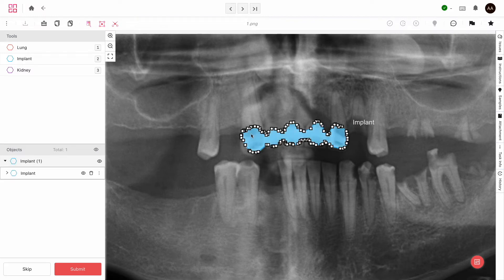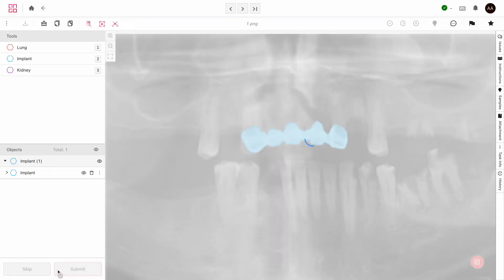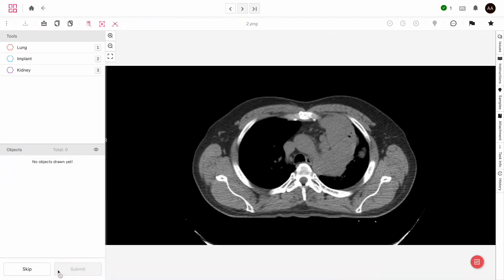When you're done labeling the asset completely, just click on submit here on the lower left corner, and you'll be shown the next asset.